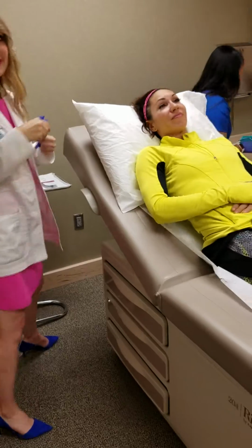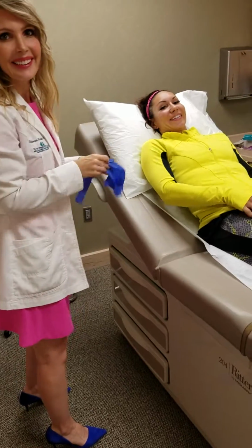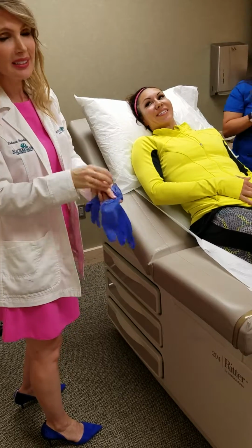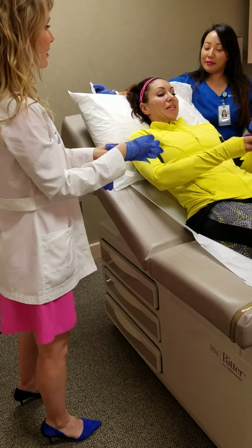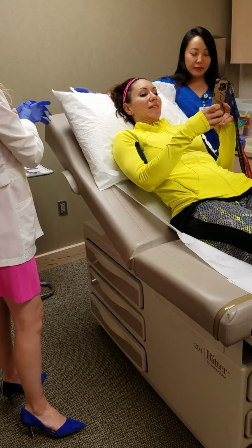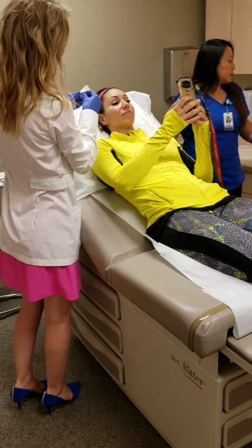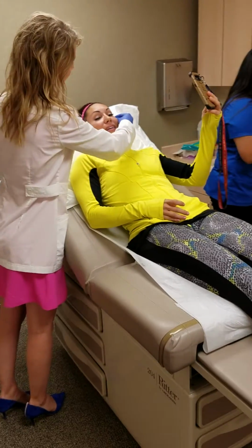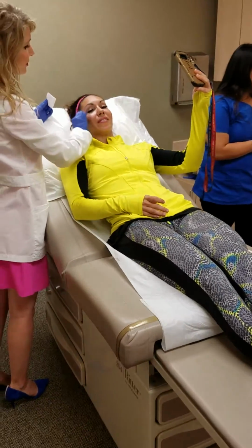Any questions yet about what we're doing? I mean, I know a cannula sometimes is a little scary to patients, but it really is the safest way to deliver product to the area. It honestly is. See if I can get my live drawing. Alright, let's do this. Maggie's going to be on Instagram doing a video from her perspective. Checking it out.